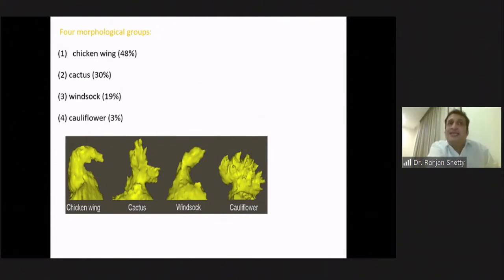But fortunately enough, if you look at the trials and look at the experience of people now, whatever device you have in your shelf, you are still able to close 98.5% of left atrial appendage. That's good, because when the PROTECT trial was done, that number was 87.5, and with PREVAIL it was 95.5. But with WATCHMAN registry now, we know that number is 98.5.